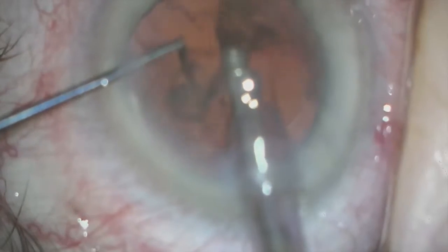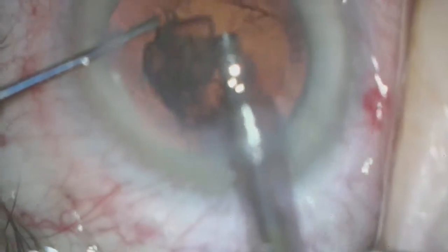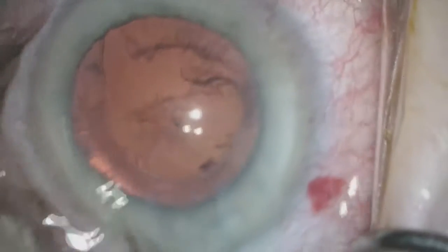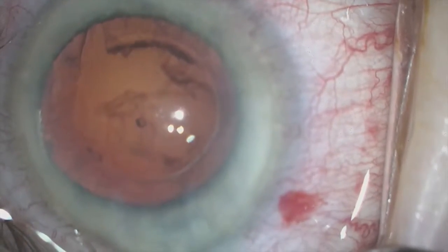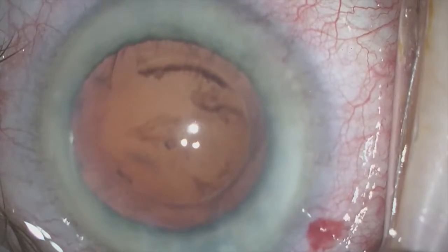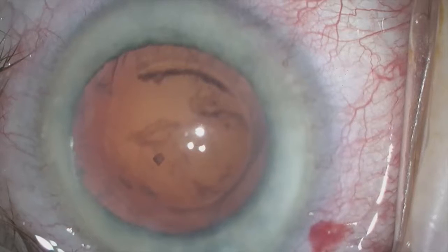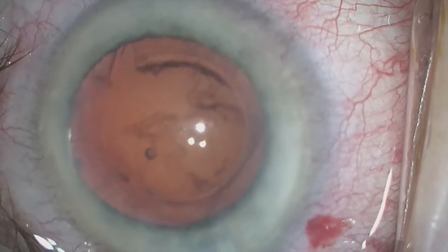This is the last quadrant of the lens coming out, and you will see as we remove it, you can see a very small cube of nucleus remaining. Initially, we thought this was inside the capsule as we knew the capsule to be intact. However, as you will see as I focus deep and more anterior and back and forth with the microscope, this cube is in fact floating in the anterior portion of the vitreous.